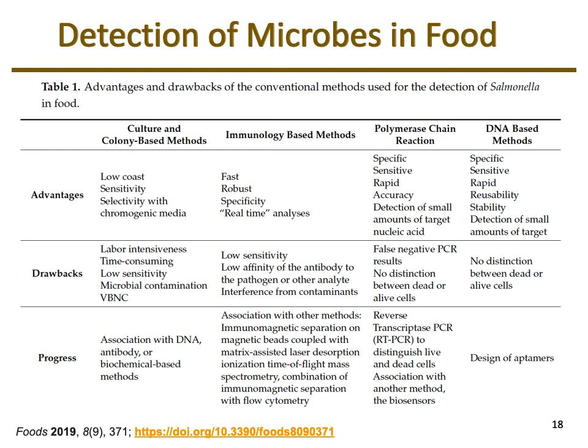And also you need antibodies that have good affinity to the pathogen or material from the pathogen, and so that's not always possible. Okay, so this is where things like PCR come in. So PCR is highly sensitive, it's rapid, it can detect whether there's a small amount of nucleic acid present, and so you don't have to have the cells alive. The drawback would be that you can't tell whether the cells are alive or dead. You just know that the genetic material was there, so it may not be present.